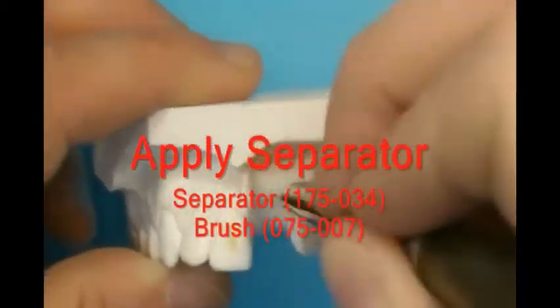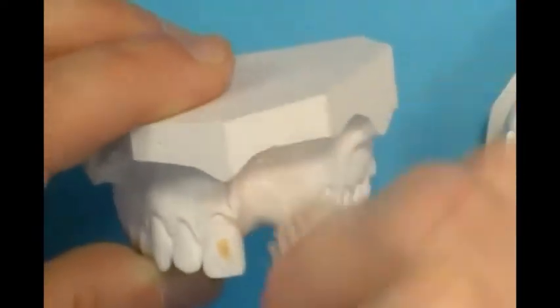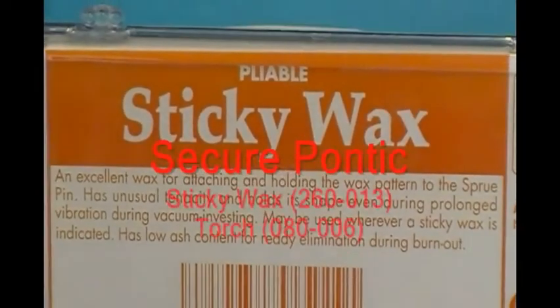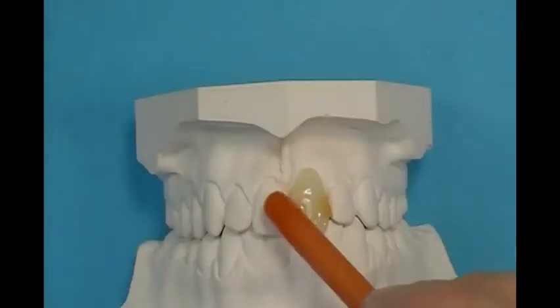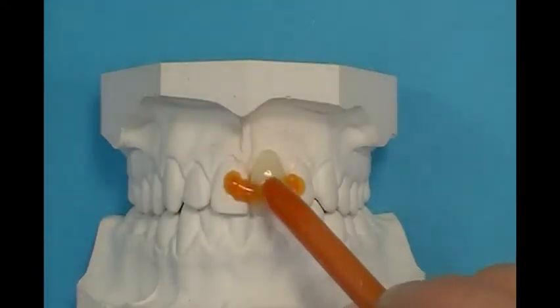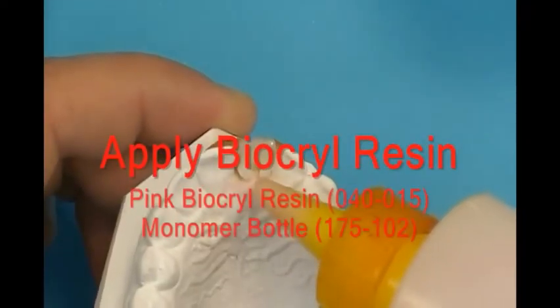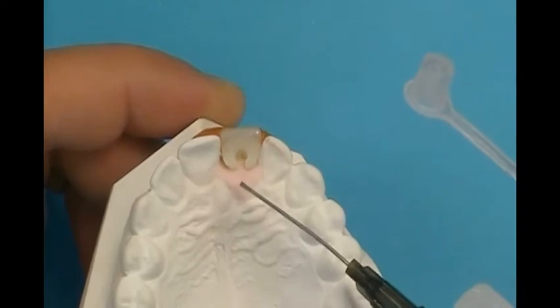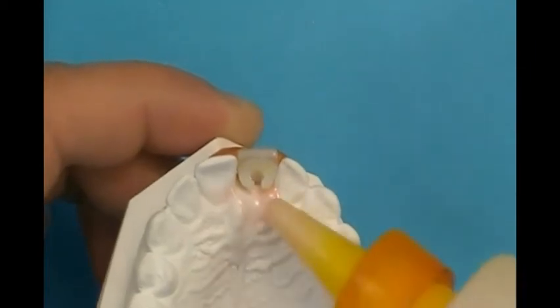Apply separator material to the edentulous area of the model and spread separator evenly with the brush. Sticky wax is used to stabilize the pontic to the model. Heat one end of the sticky wax rod and apply it to connect the model to the pontic. Using the salt and pepper technique, apply resin to flow around the base of the pontic. Create a saddle-like foundation over the edentulous part of the arch to stabilize the alignment of the pontic.